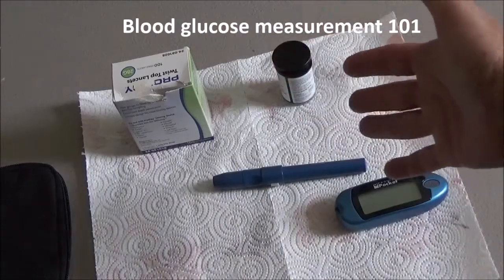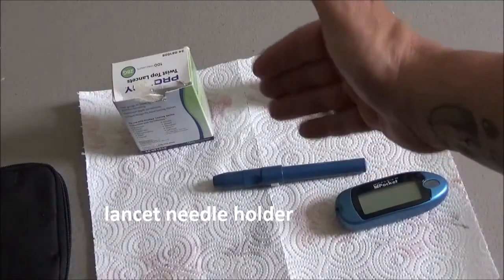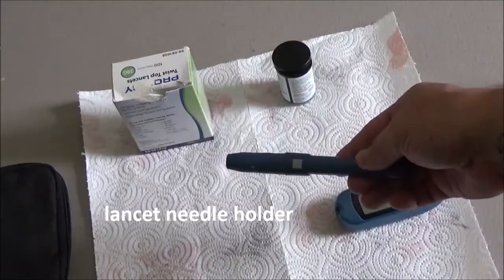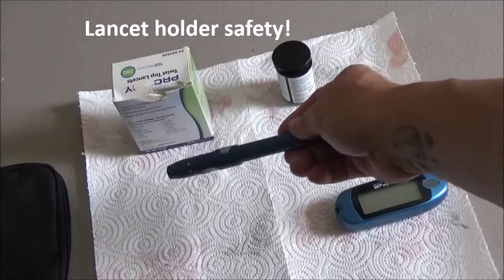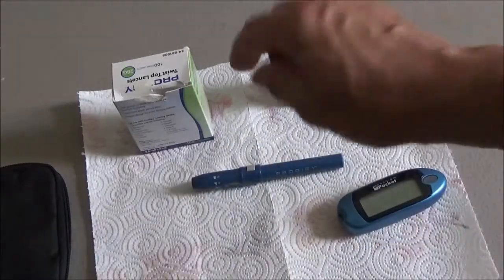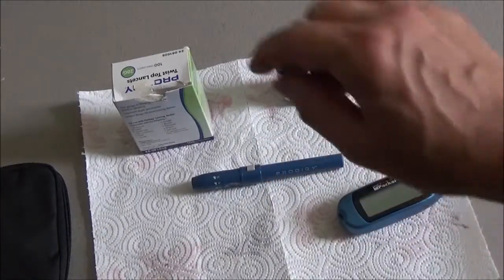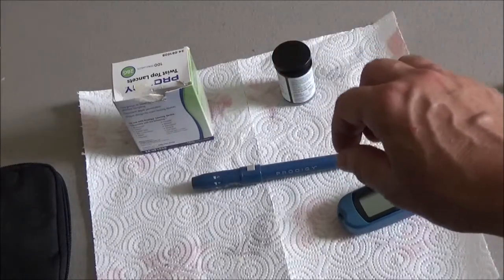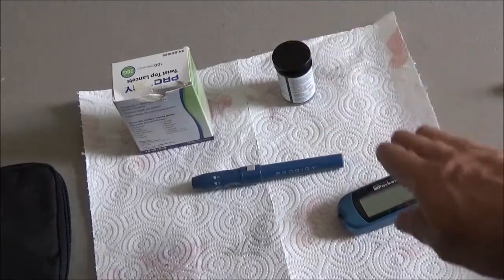All right, human physiology students, this is a blood lancet holder, and inside this holder might be a dirty needle. So as future nurses, I would hope that you look at a lancet holder on a countertop that is in the closed position as a potentially loaded gun. This could have a dirty needle inside it. So whenever you encounter a lancet holder, you must be sure that it is clear and free of any needles that have been possibly used.